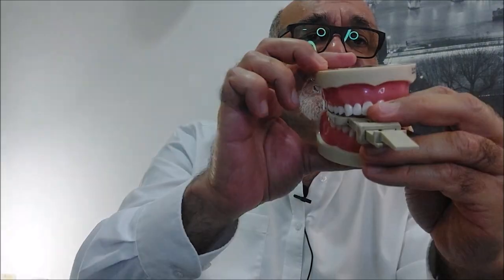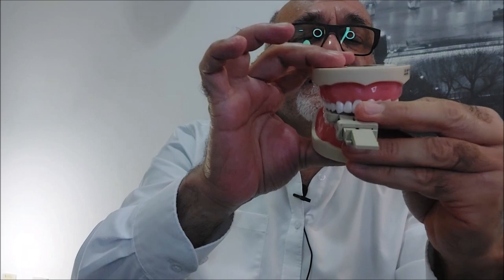Don't place it with the sensor sticking out too far because it will be hard for the patient to bite. Push it as much as you can in an inward direction.